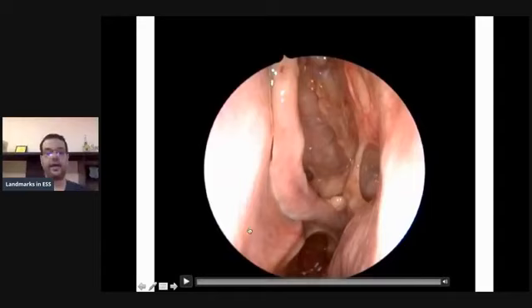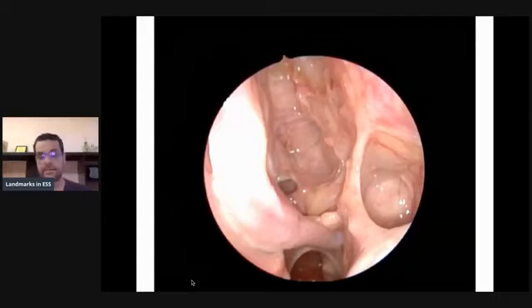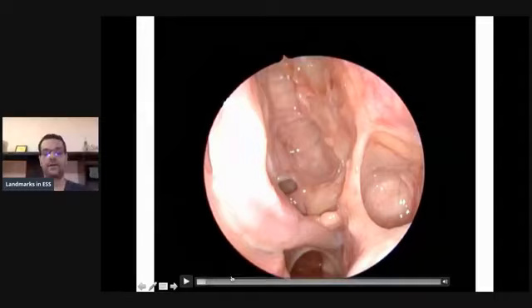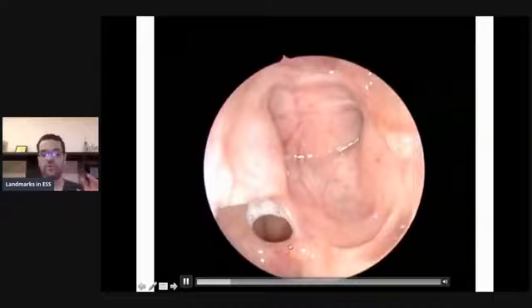That's a demonstration of a postoperative case showing you everything opened up and what you need to have in your polyp cases, AFR cases, revision cases, pretty much clearing everything and opening things up widely. Let me show you. So that's the left side. That's the middle turbinate trimmed in order to be nice looking, not obstructing the airway. That's the superior turbinate. The inferior third was removed. And this is the sphenoid sinus opening.